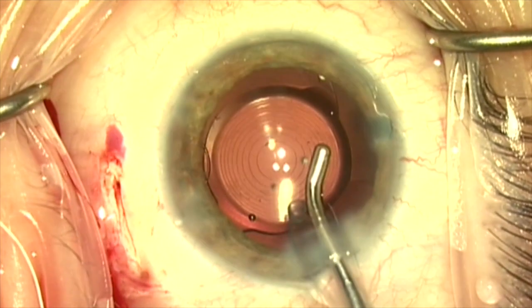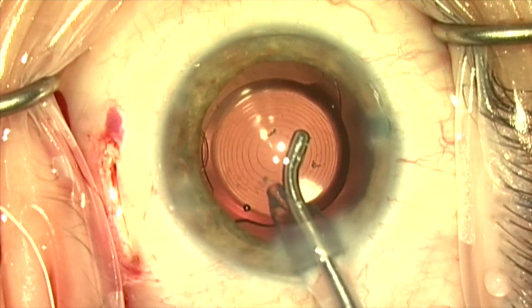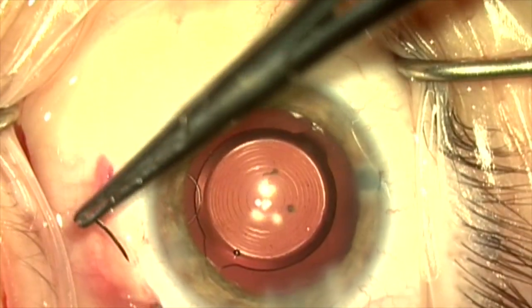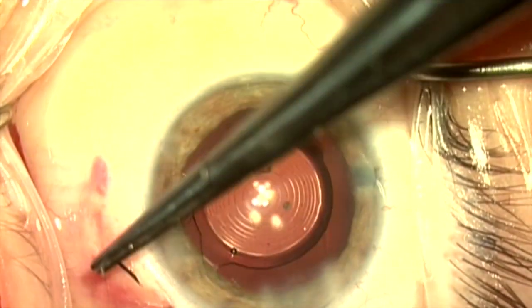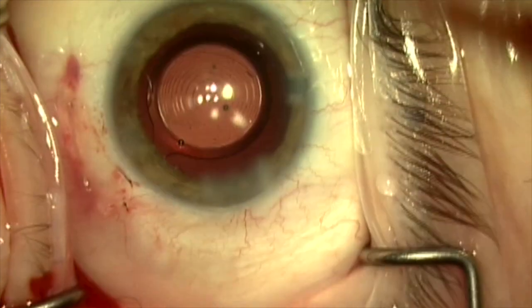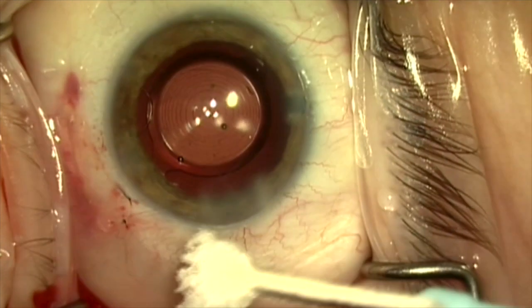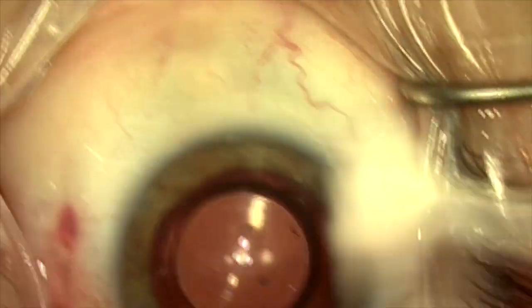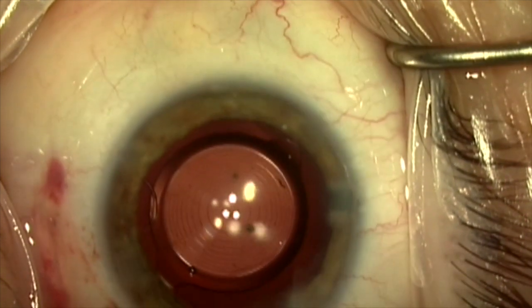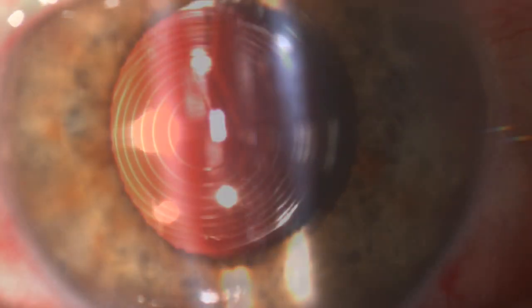Here I'm removing the viscoelastic, and as I do this you can see just how stable this lens-bag complex is — it really is very much like normal cataract surgery. We're going to go ahead and close conjunctiva tight, which will provide a little more pressure on that scleral shelf I've created. Everything is nice, stable, and centered. This is day one at the slit lamp — the patient's vision was 20/25 uncorrected. Thank you for your attention.